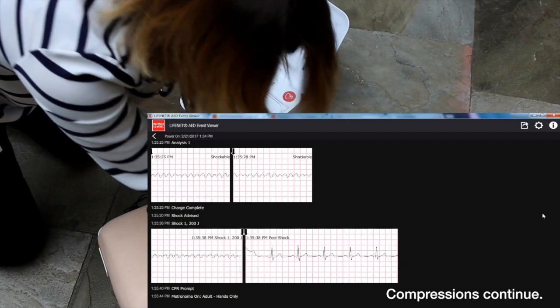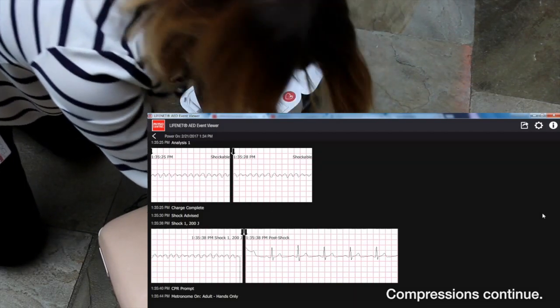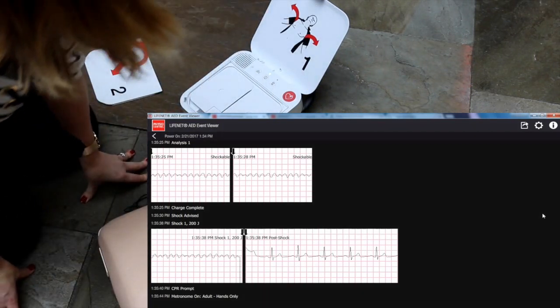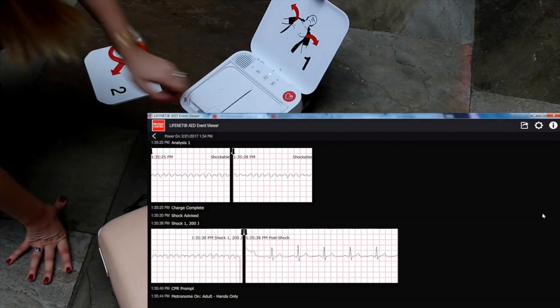You have 1 minute to go. Stop chest compressions. Everyone clear. Press flashing button. Shock delivered.